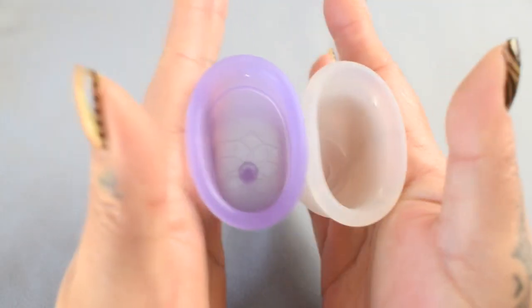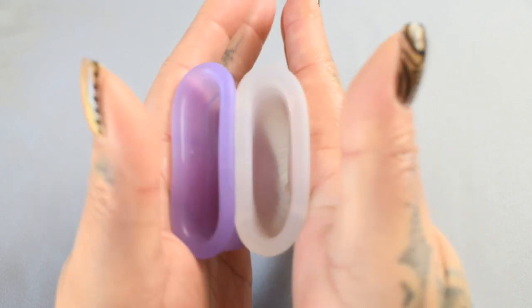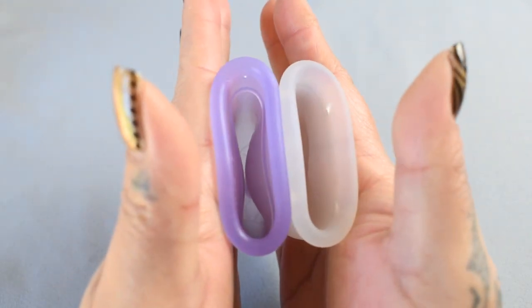Here is the inside of the Venus cup, and the inside of the Lena sensitive. Again, these are both the large sizes.